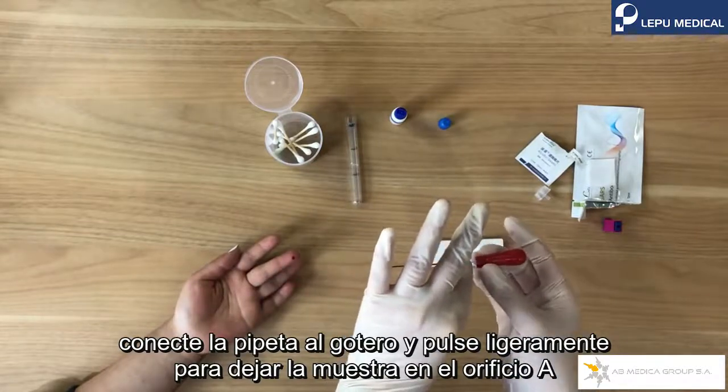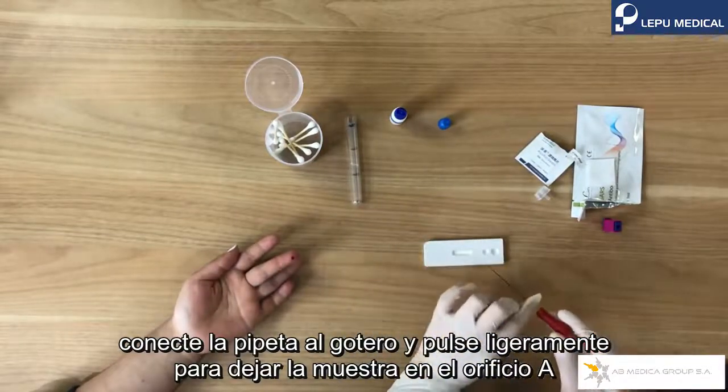Connect the pipette with the dropper head, and squeeze slightly into sample well A.